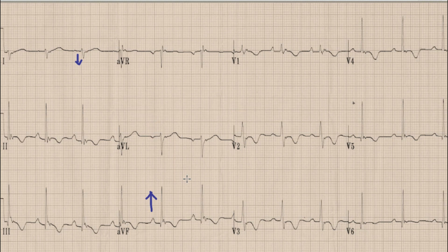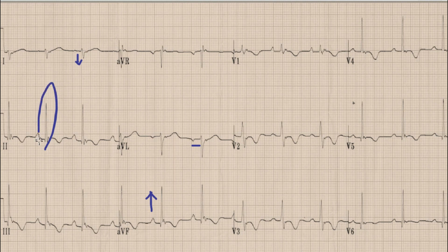Moving on to the duration of the PR interval — it is within normal limits, less than 1 large box or 200 milliseconds. Next is the QRS complex. It appears narrow in limb leads, less than 100 milliseconds. However, in V1, V2, and V3, the QRS complex is a bit broader, around 110 milliseconds in these leads.